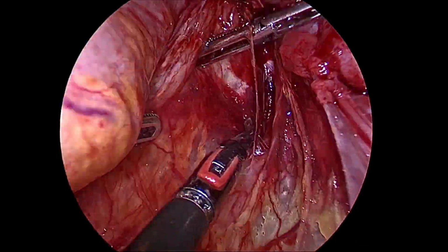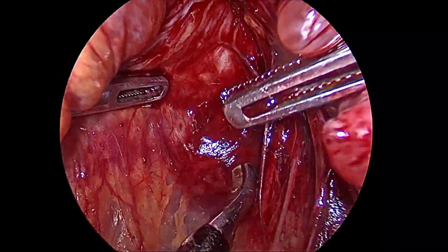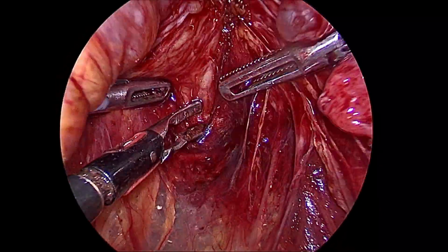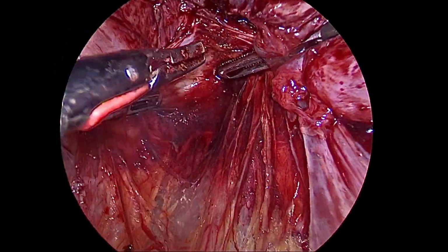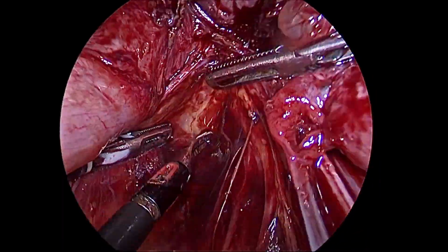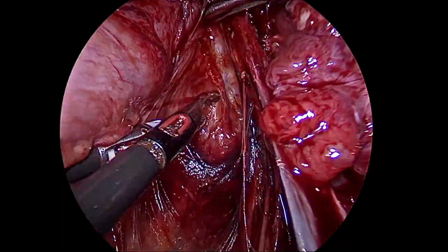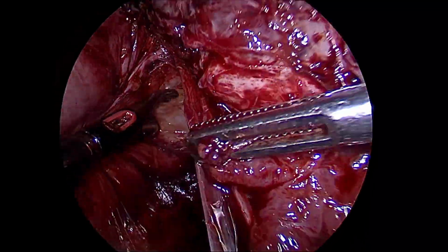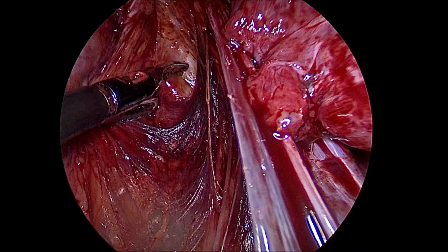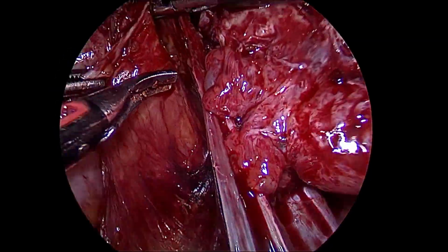Now here the role of the assistants comes very important. As you can see, he is helping me do the blunt dissection on the other side and creating a space between the bowel and the lateral pelvic wall. This also ensures that the ureter goes laterally, out of the way, and we get a relatively safe space for dissection without causing any unintended damage to the bowel.